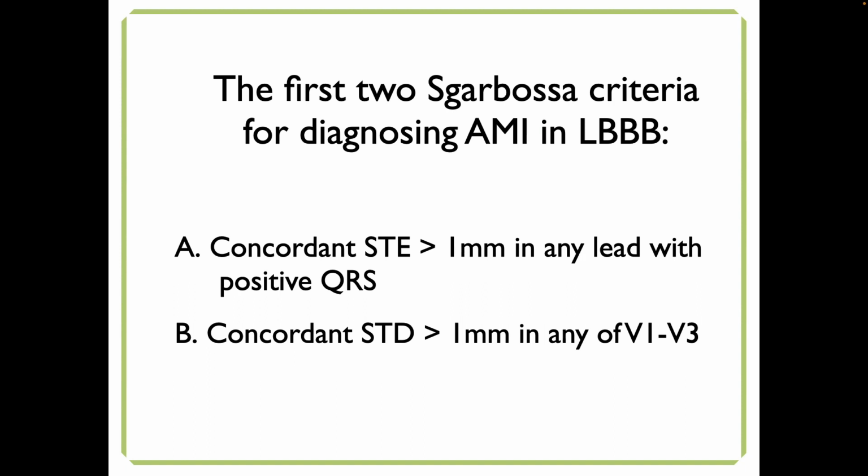So I'll read through it. You'll go, wait a minute, what does this have to do with uppies and downies? And then I'll show you examples, and it'll make total sense. Now, if something is not discordant, it's concordant. So if an uppy with a downy is discordant, an uppy with an uppy is concordant. A downy with a downy is concordant. So that's what that means.